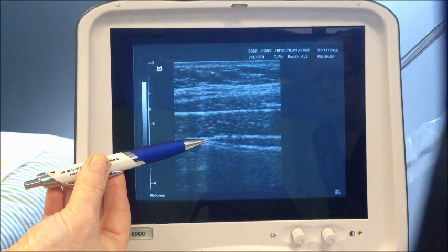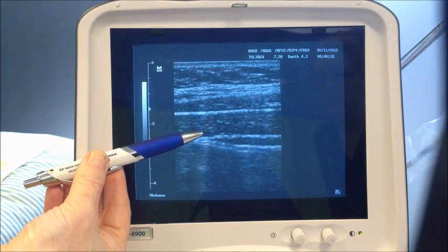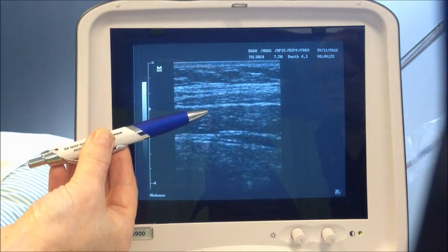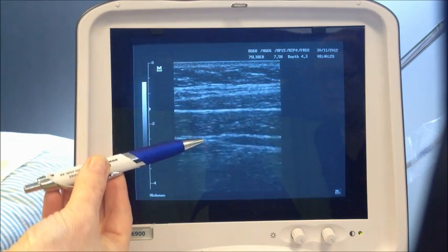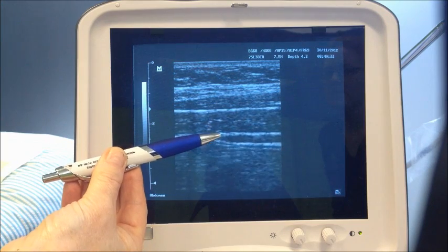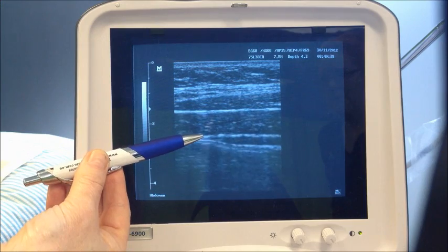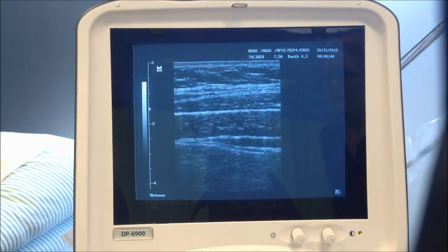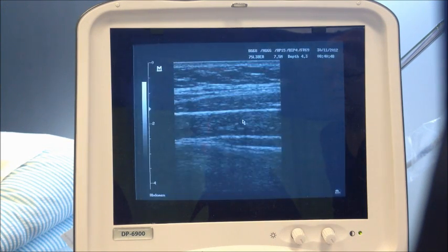So first of all, I'm going to ask the patient to do what we would consider a poor contraction or an incorrect contraction. So just tighten and brace for me. Okay, so what we've seen here, hold, and let go, is that we've seen all the muscles tightening and thickening. The transverse abdominis thickened, so did the internal oblique, and so did the external oblique. The transverse abdominis did not slide around to protect the back and the spine.